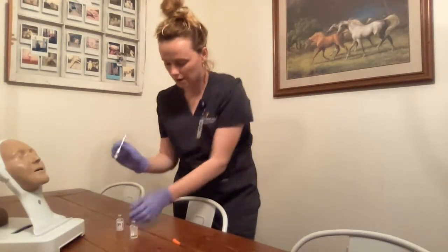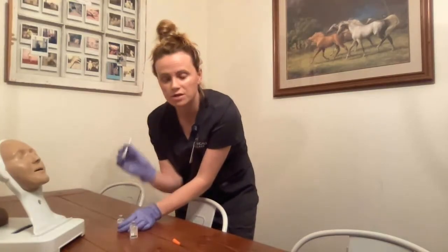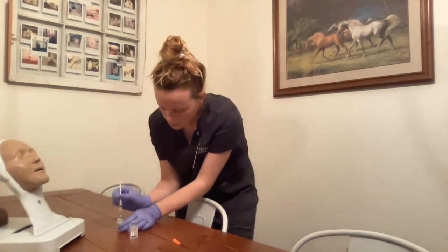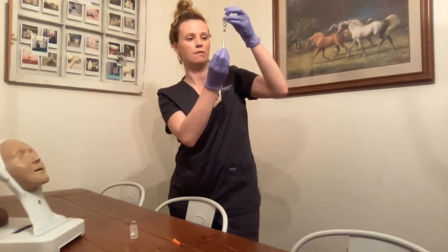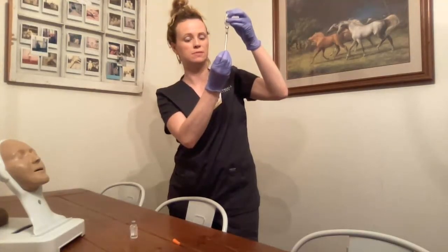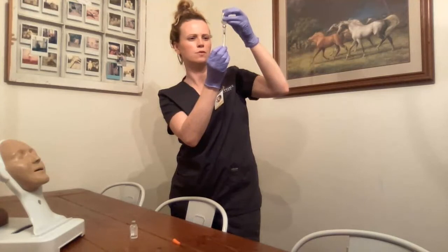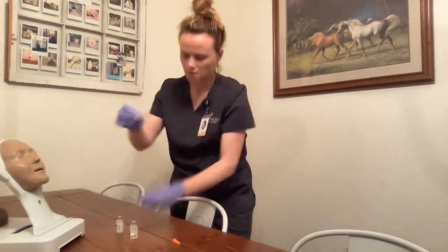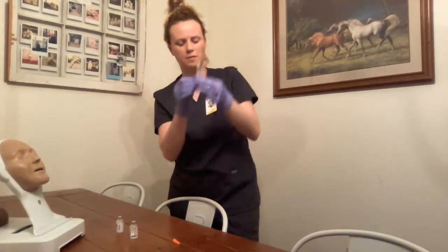Now I can draw up the intermediate medication, but I have to make sure I do not administer any of the regular into the vial, and I also want to make sure I do not overdraw. I have four units already drawn. My total dose needs to be 12, so I will draw up to eight more. 12 total — the nurse and I have both verified against the MAR. I tap to make sure there are no air bubbles.